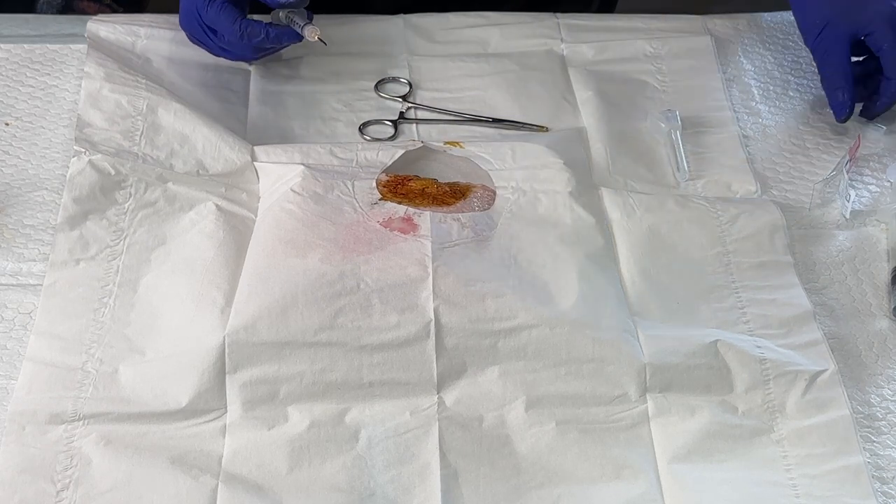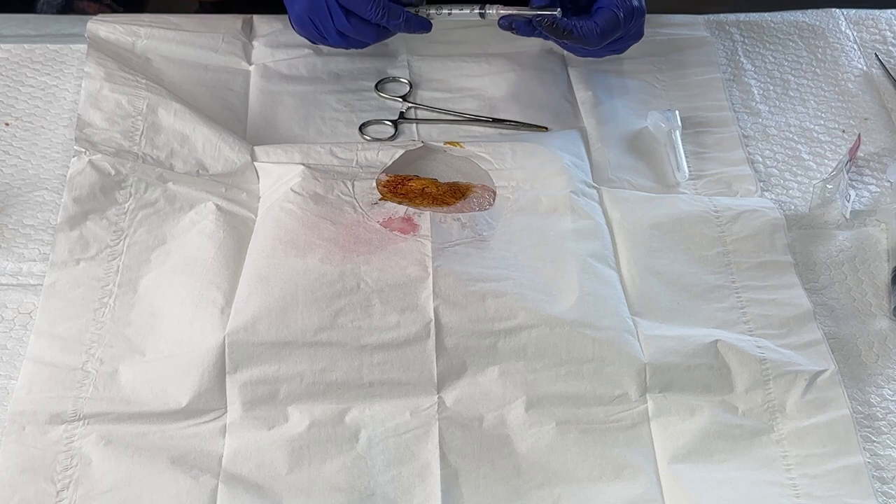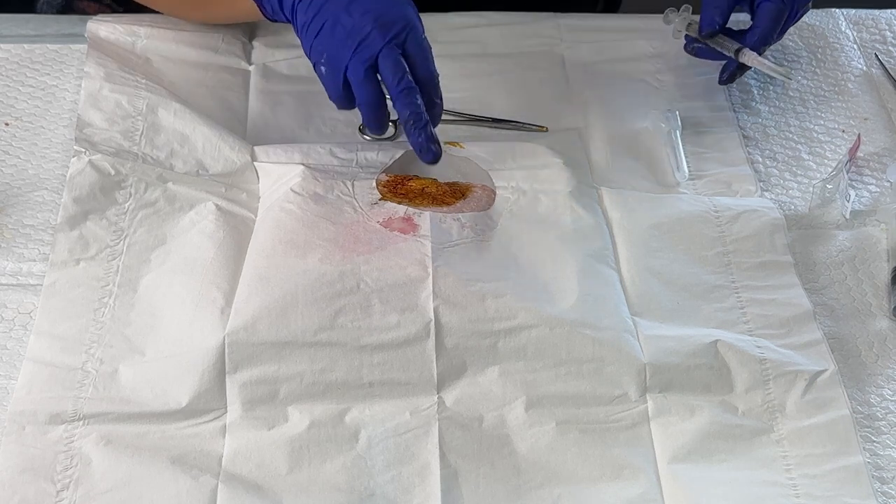And so that's how you would aspirate, and you could also inject steroid if you wanted to within a ganglion cyst.